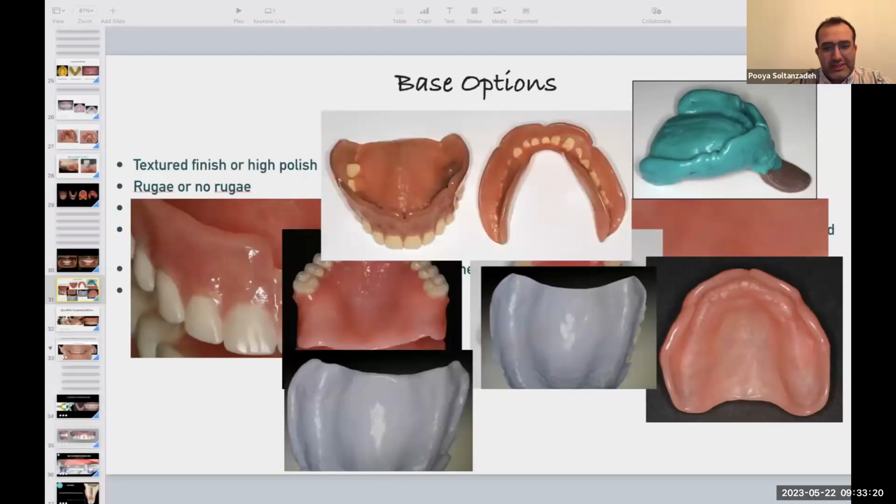So the mill bases can be made just like the conventional way. They can mill the base, and if it's monolithic like that, they put the teeth and mill from inside, and you can see the base of the teeth. They call it reverse milling. And this is what I'm talking about, customization of the denture for some special patients who request that.